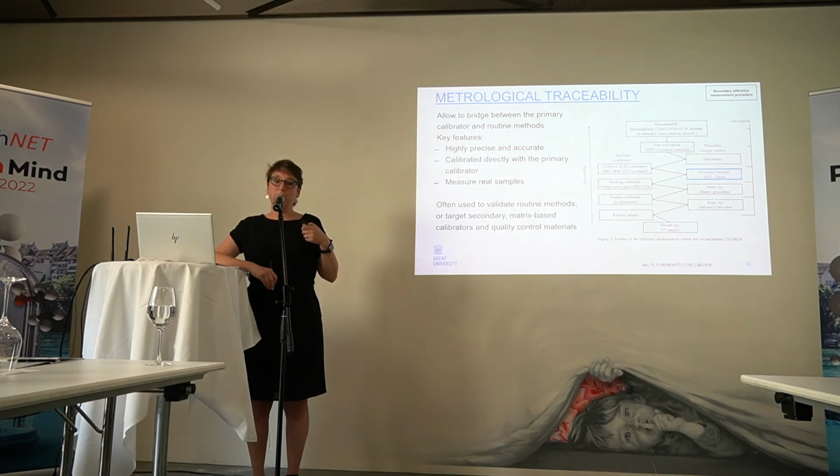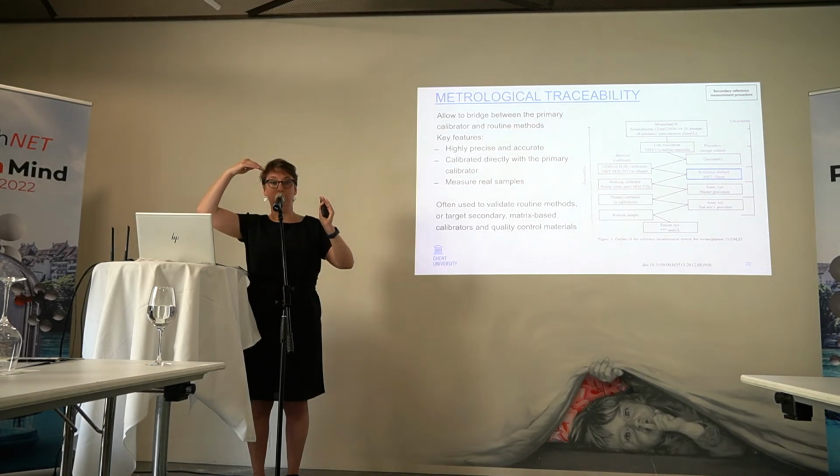So, and then, of course, we use these reference measurement procedures to target real samples, and it goes like this. It's an EQA organizer, or it's a Siemens, Roche, whatever, who send us samples, we target them, they take the results back home, and they use it to set the basis for calibration of their method or to check accuracy of their methods.